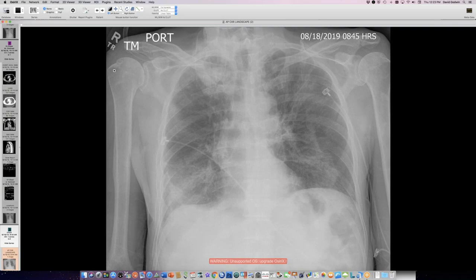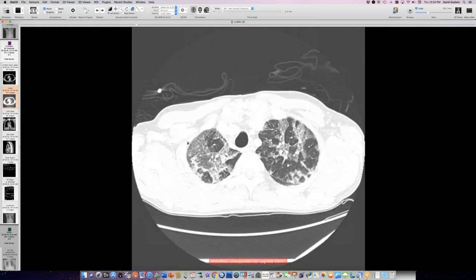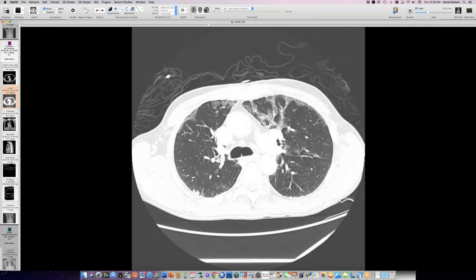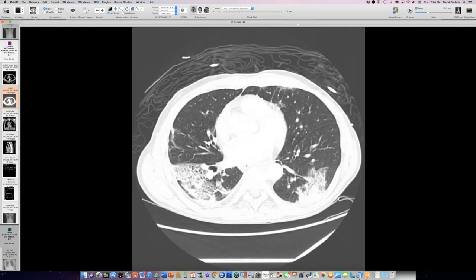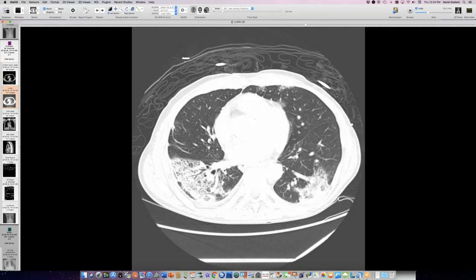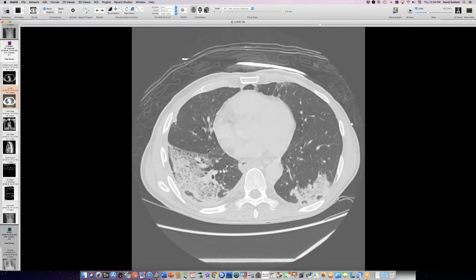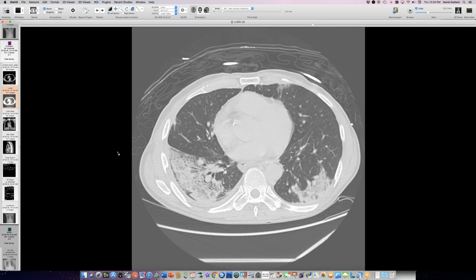Here's a fellow who got short of breath. This was an early radiograph from the outside. The patient has patchy low-grade consolidation, worst in the right base. Around that time he had a CT scan. He has this ground glass abnormality with a very nice crazy paving pattern and sharp geographic margination. I was thinking: was this guy perhaps doing sandblasting? Could this be acute silicoproteinosis? That would be very interesting.